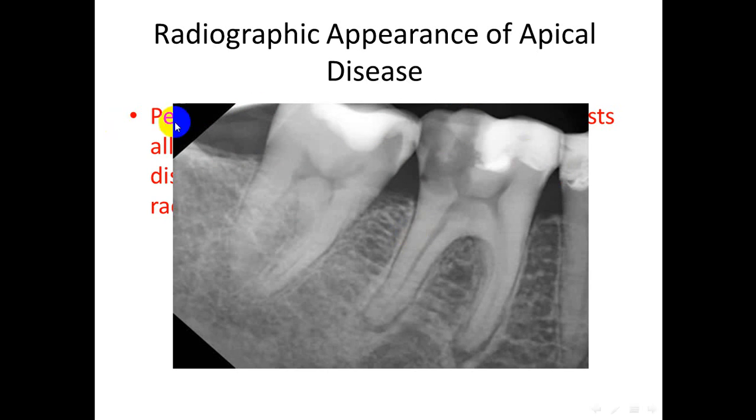All that scenario, all that story starts with deep caries, which is frequently seen, and should start with widening of the periapical area.